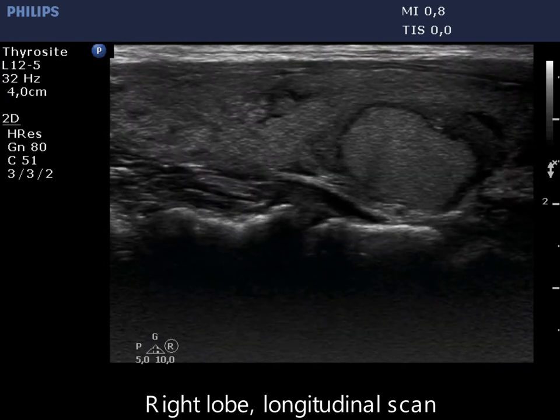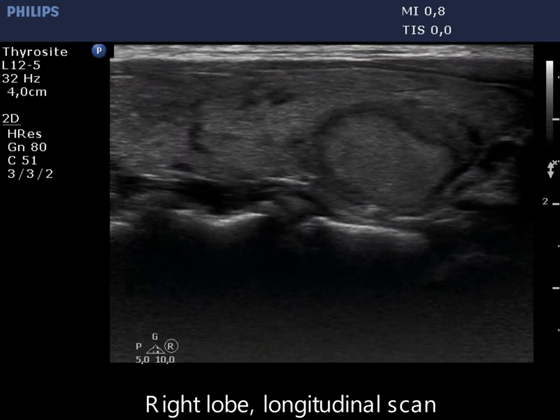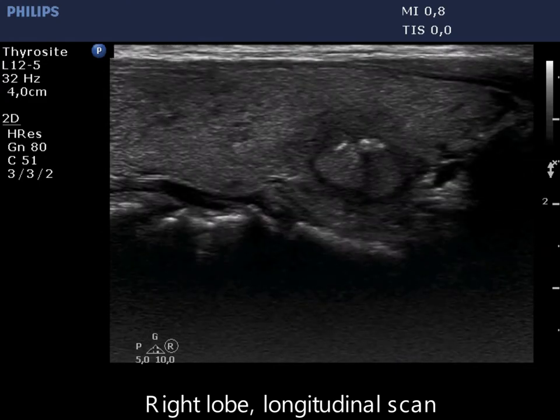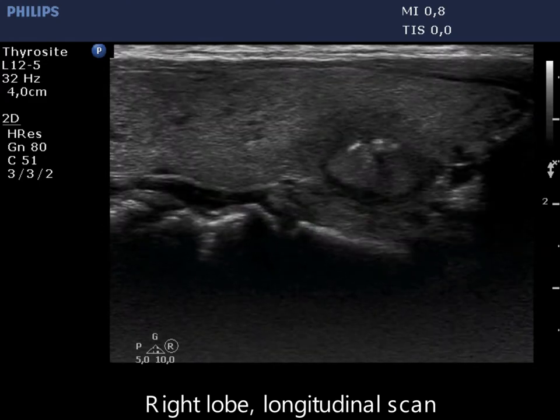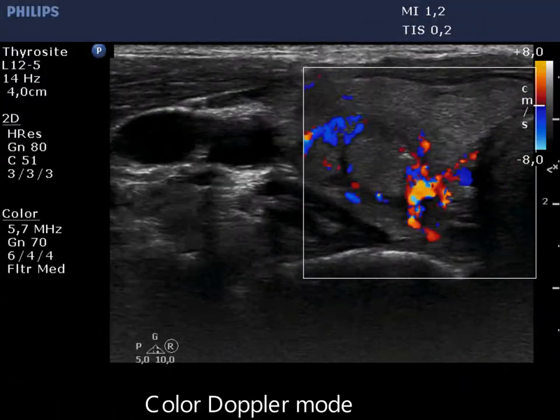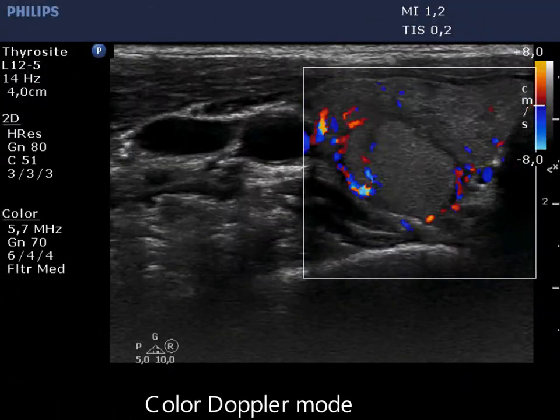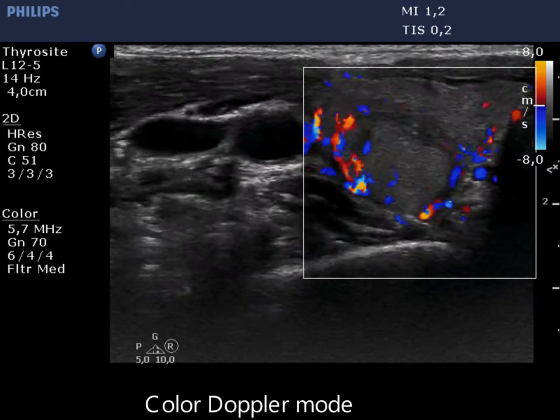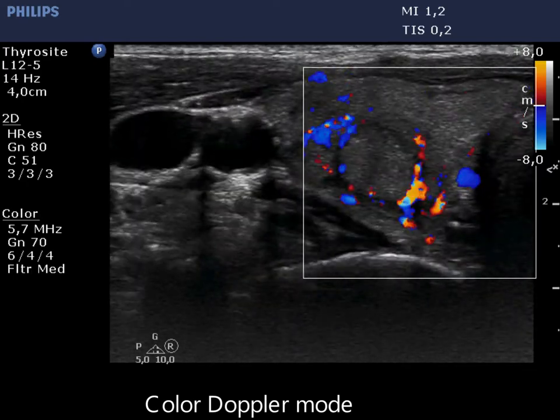Note that the lesion presents punctate echogenic foci. The lesion has paranodular blood flow.